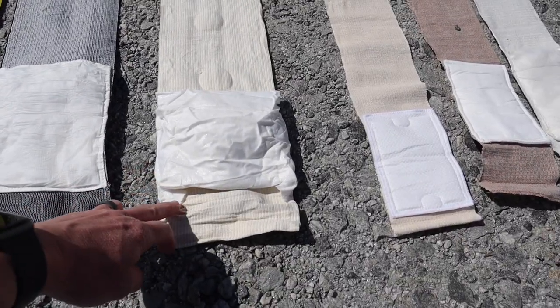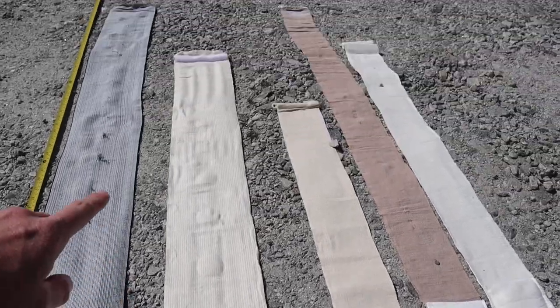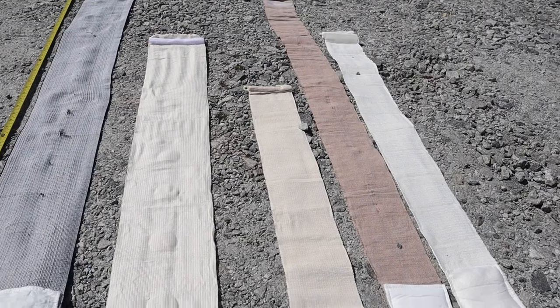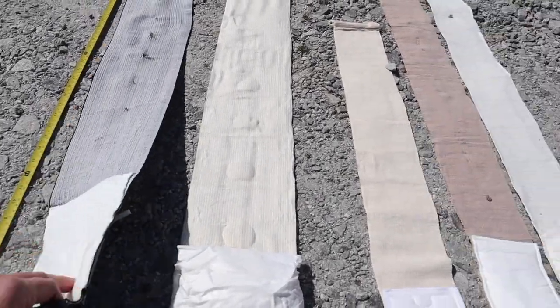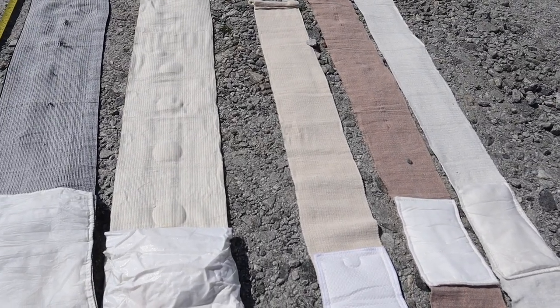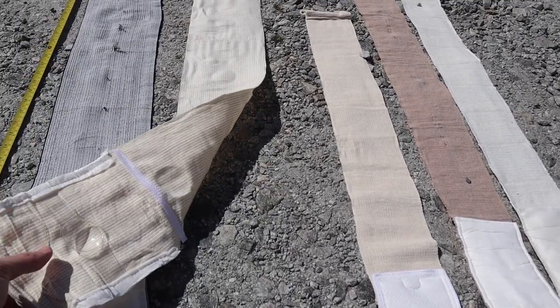This pressure bandage right here is the Elias. You can see the distance on it is the six inch as well. The Israeli comes with your pressure plate. The Elias comes with extra gauze and it's an eye cup there.